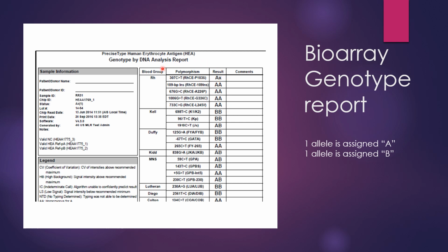So by looking at this, we don't know, is A the C or is A the T? So this report was very complicated. We elected not to share this with hospitals because we would be answering questions all day long. Even for genetic people, this report was confusing. So we liked the ID-Core report much, much better.